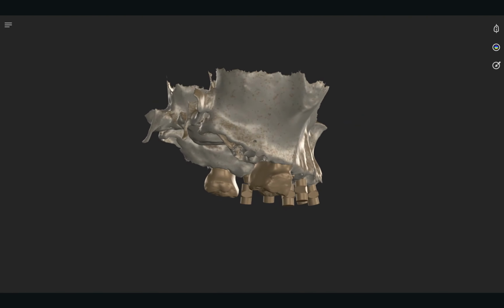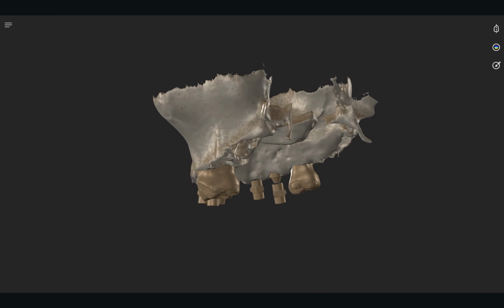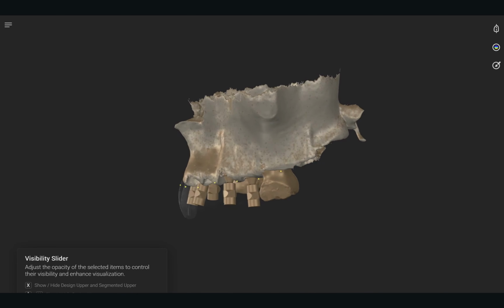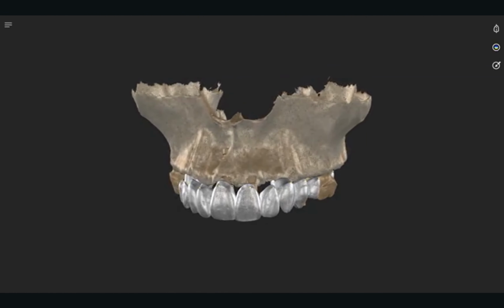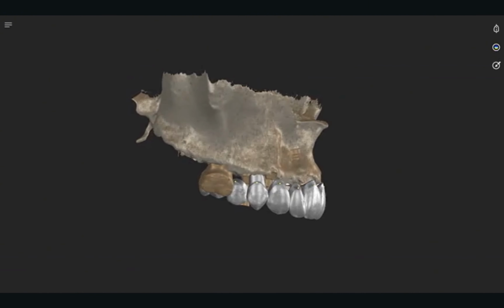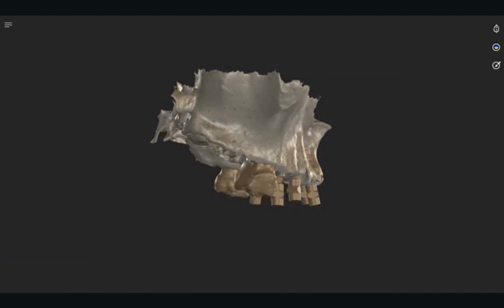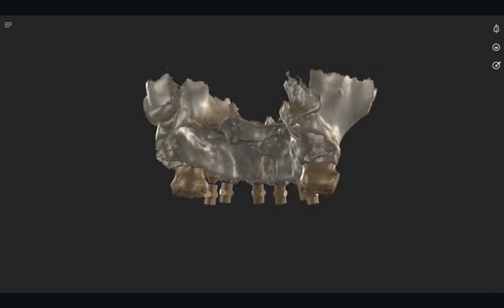It allows you to integrate 3D planning in situations like FP1s, which have always traditionally been a very challenging case. You have the ability then and there to see prosthetically how that relates to your implant placements.